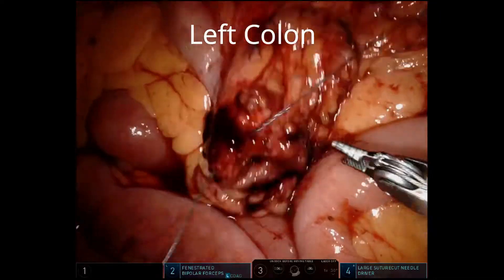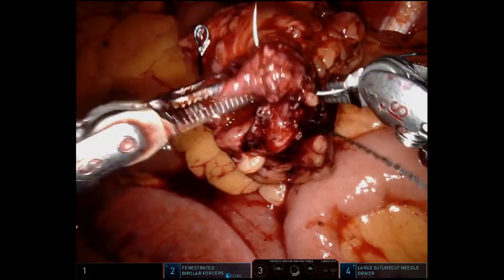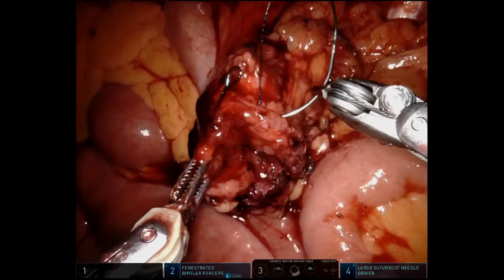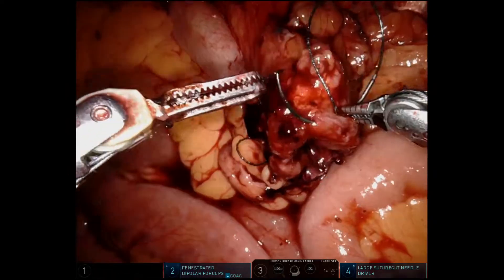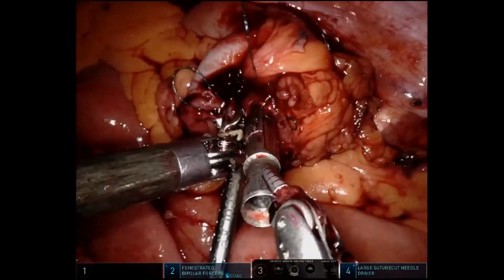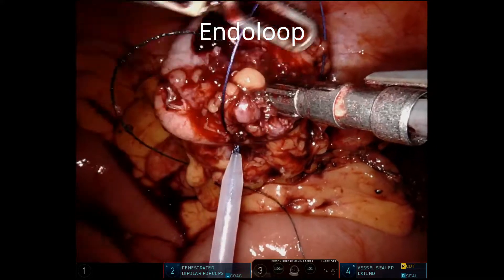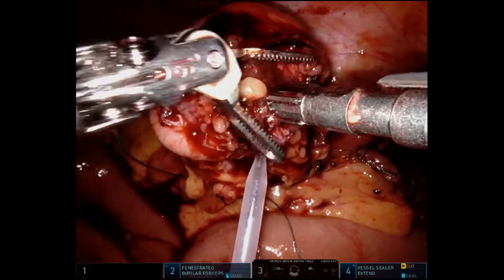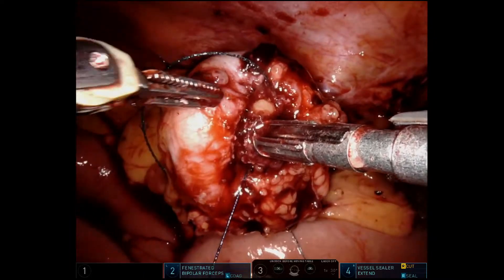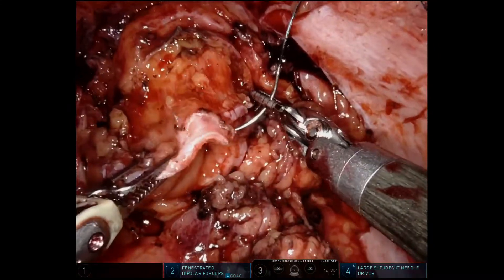Now we're getting ready to do the NICE portions of the procedure with the intracorporeal anastomosis. We use a 3-0 V-lock suture — that's what we've become accustomed to using. We loop it to itself; it takes about six in-and-out bites on the left colon. In this case we're using the 31-millimeter stapler — that's the anvil. We secure it in place and then pretty much always use an endo loop, which the bedside assist can help with easily. It really gets that tissue in very tightly, especially with diverticular disease — we don't want any of those little diverticula getting in the way across the anvil.